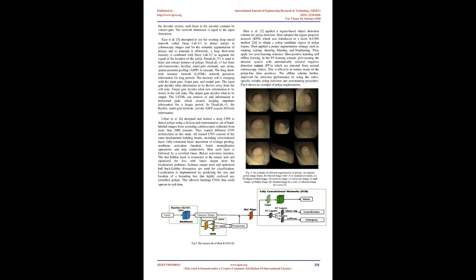The main purpose of the online network is to remove the specific polyp-like FPs detected by the offline network and further improve the detection performance. To do this, the next step is to combine the outputs of the offline network and online network to get the final polyp detection result. Through the online sample selection and offline training, the influence of hard mimics can be reduced to an extent.